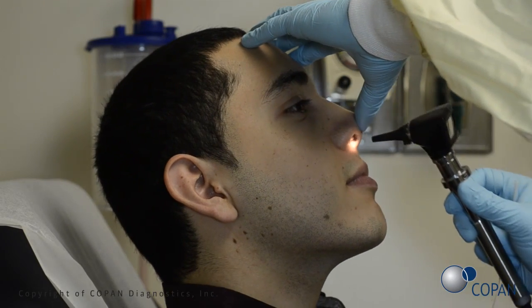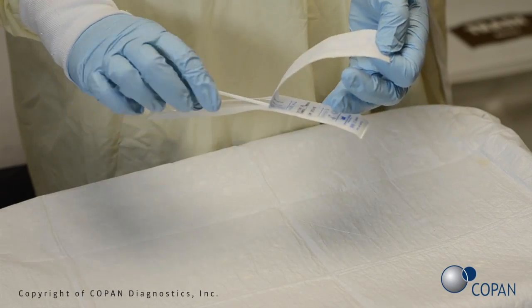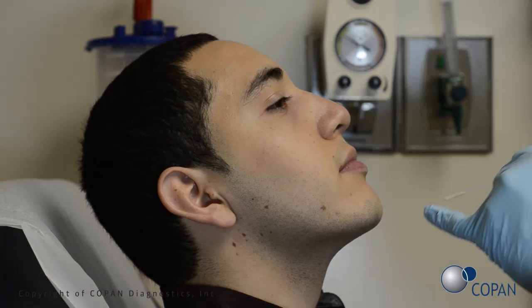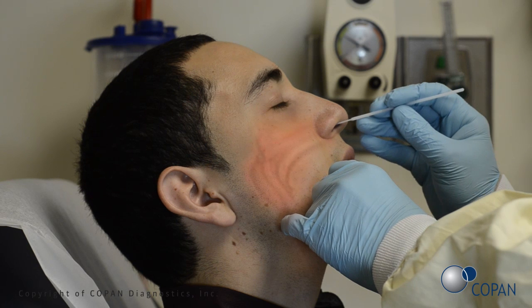Check for nasal obstructions. Open swab package. Gently insert the swab into the nostril. Keep the swab near the septum floor of the nose while gently pushing the swab into the post-nasopharynx.